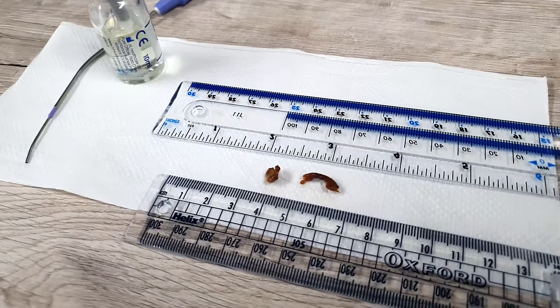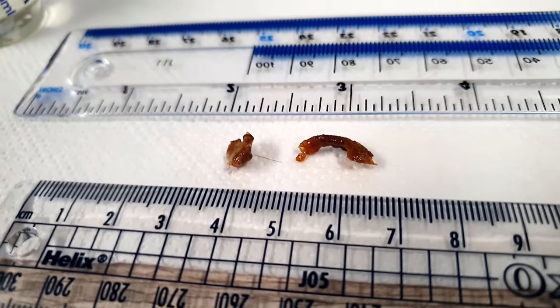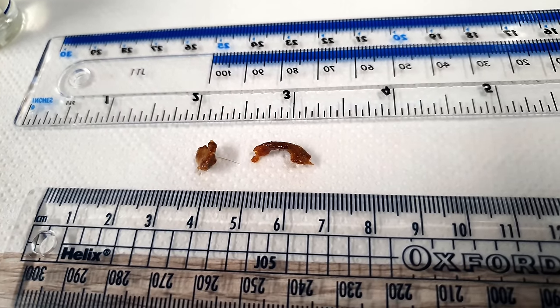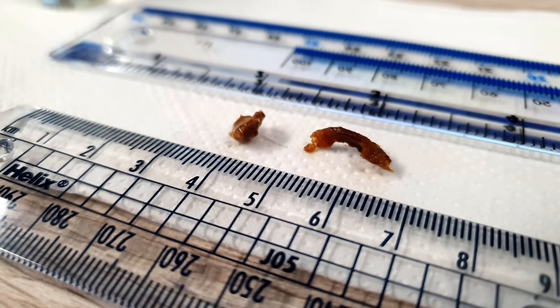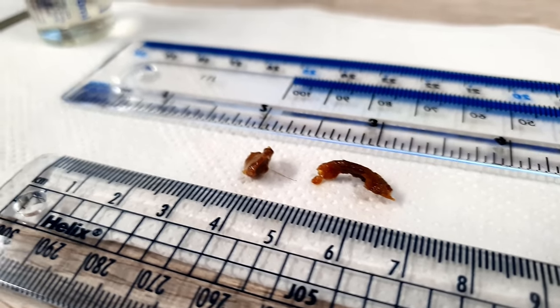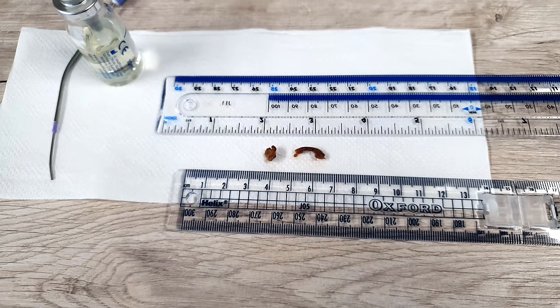But nice and oily in there. Here is the debris that we removed — so all together, probably two centimeters, an inch, something like that. In terms of quantity, it obviously wasn't blocking the ear because we could see the eardrum right from the off. But it had been shoved right down against the eardrum, so obviously very uncomfortable for the patient. A very short one today, very easy one, but I thought it was very interesting given that that's basically what wax looks like sometimes when you twirl a cotton bud in your ear.